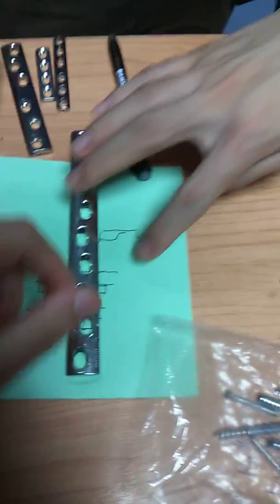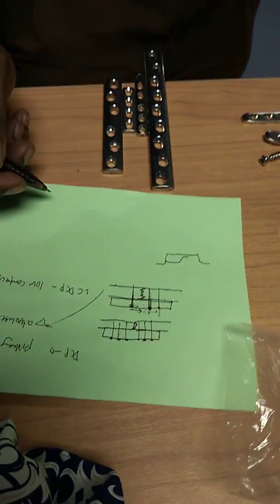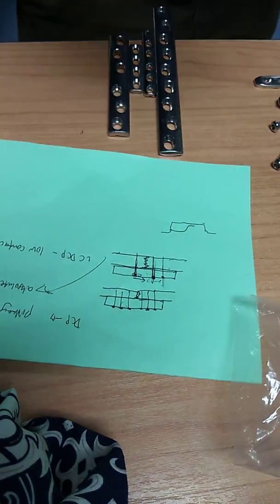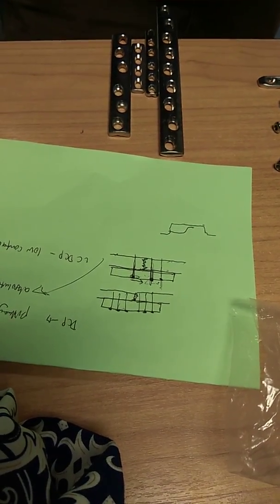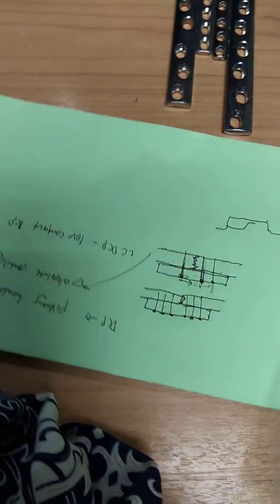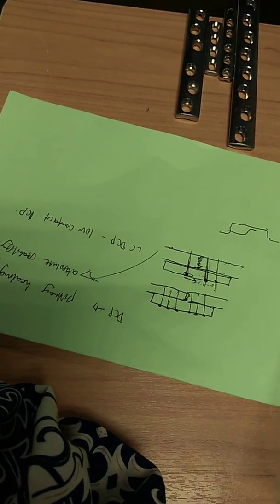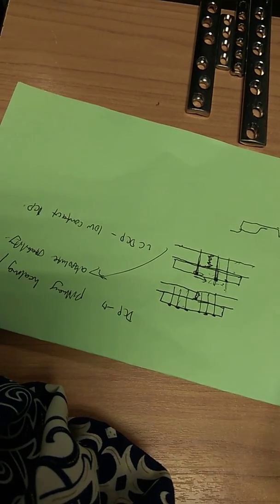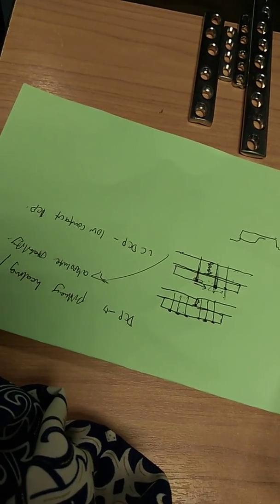So boss, usually 3 screws is enough? Okay, very good question. Depends on the type of bone. If it's a small bone, you're using a small DCP or narrow DCP. Minimum of 6 cortices has to be purchased on each side, meaning 3 screws at least for small bone. Whereas for larger bone, a minimum of 7 cortices has to be purchased. I don't know why they say 7, but normally it's 8. So minimum of 7 cortices has to be held by screw on each side of the fracture. So that means it's equivalent to 4 screws per side. Alright? Understand?